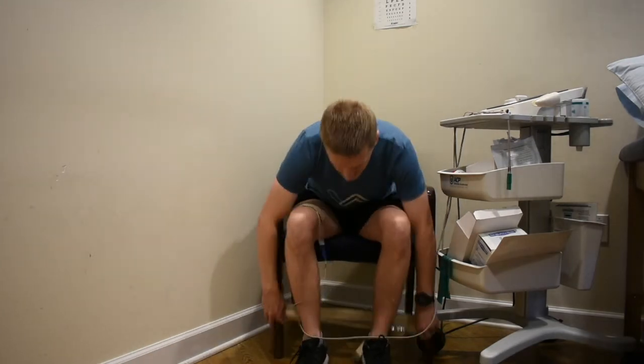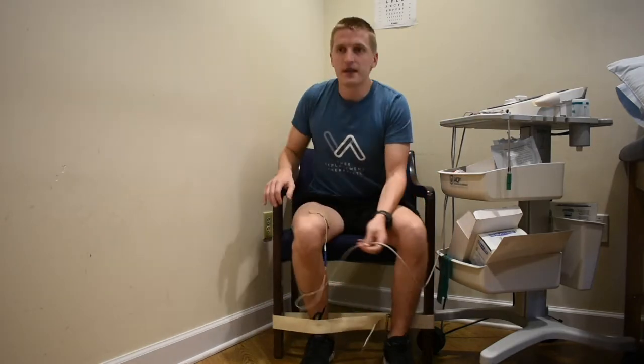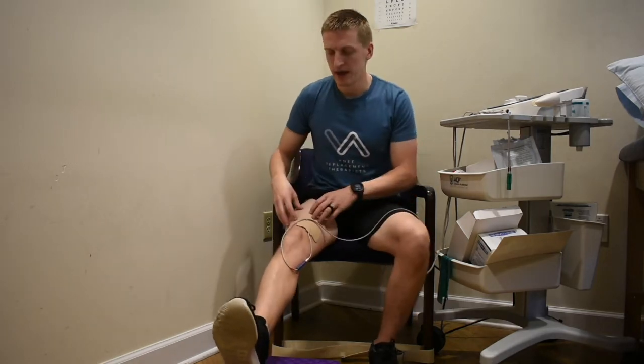There are two setups I like to use for the isometric contraction. First, sitting in a chair with a loop band wrapped around the chair leg — you tuck your leg in and push into the band during the contraction so your leg isn't moving. The other option is a quad set or straight leg raise: put your leg out on a stool or chair, or do it lying down, and when you feel the stimulation, squeeze, push your knee down, straighten the knee, and hold.